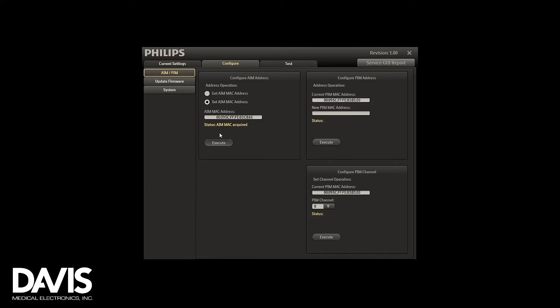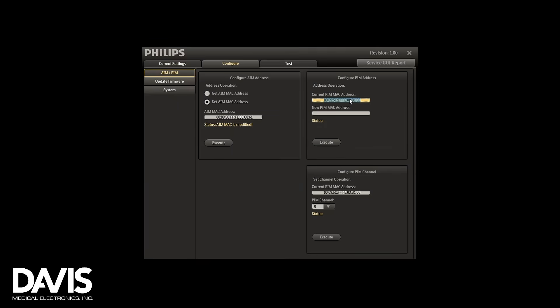Next, to configure the PIM module, type in the Mac address located behind your patient module. Make sure that the module is turned on.